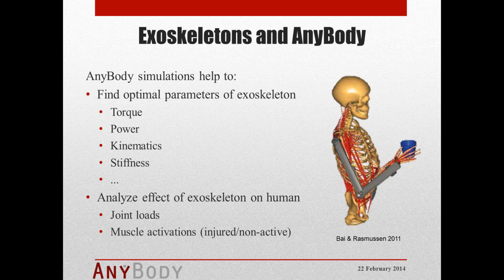On the other hand, if you have developed your exoskeleton already, you can evaluate it. You can analyze the effect of the exoskeleton on the human being. How will the joint loads change from a human without an exoskeleton to a human wearing this exoskeleton? How will the muscle activations change?